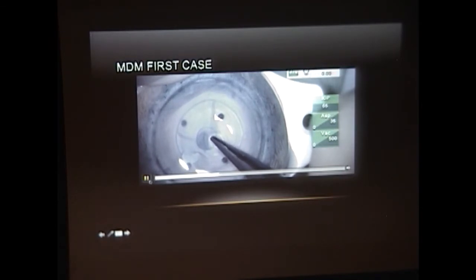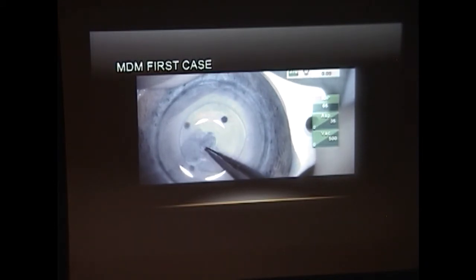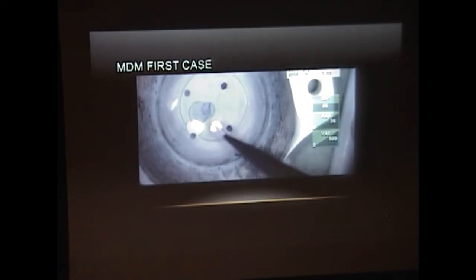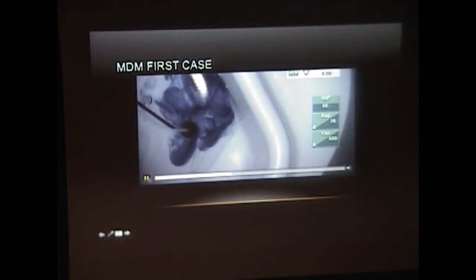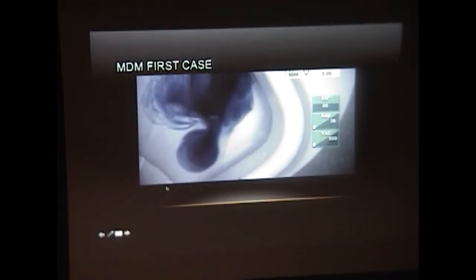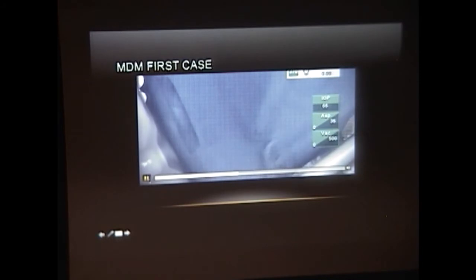So now the tissue's being stripped. It's pre-stripped, and this is actually from a different eye bank. This was pre-stripped peripherally and was still attached centrally, but it doesn't really matter. There it comes off and scrolls tightly immediately. And we've placed it in some BSS here. It's not very well stained, so we're going to add a little more trypan. And after a little more BSS, it gets sucked into the injector.